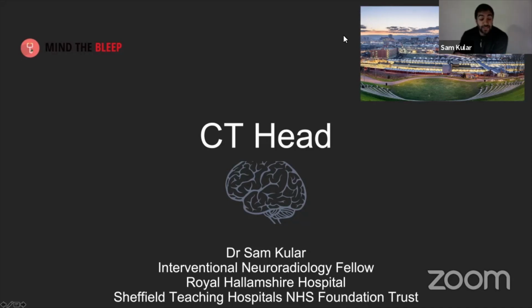Yeah, great. Thanks, Kevin. I'm Sam. I'm one of the radiology trainees here in Sheffield in the UK. Today I've been asked to talk about CT head interpretation and just a bit about scanning and the modality itself.